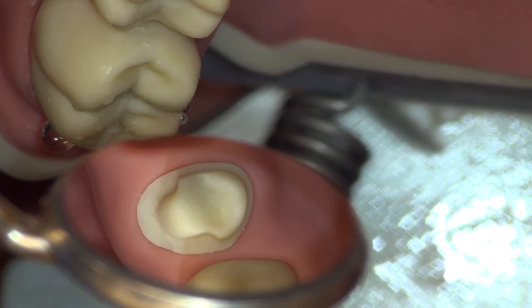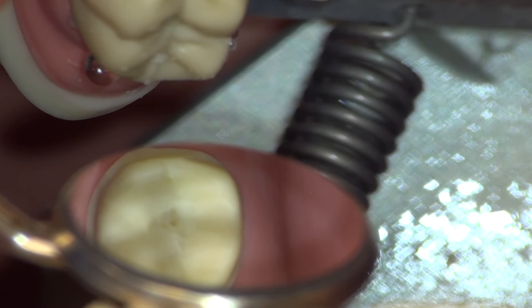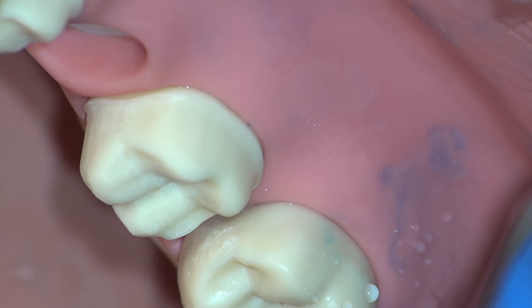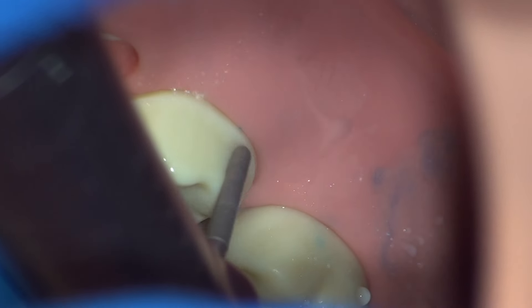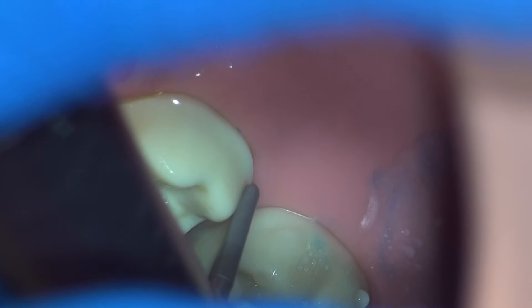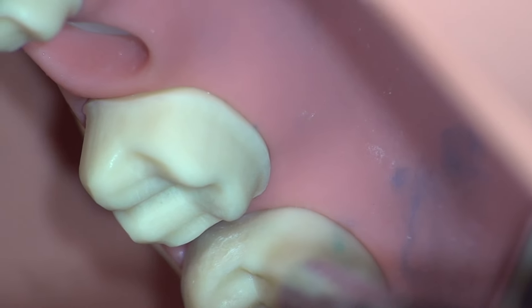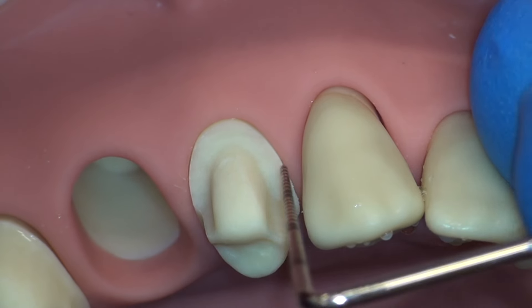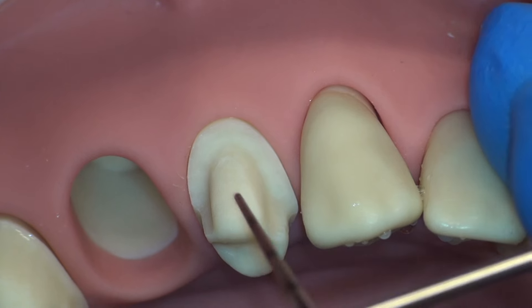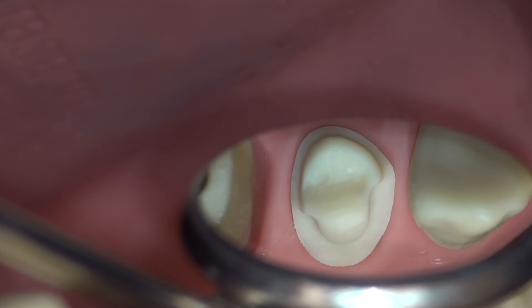Finally, we'll check our path of insertion and undercuts with the mirror. Here we can see a distal lingual undercut on the molar. We'll verify this visually, and then reduce with our burr at slow speed with a red diamond — it doesn't take very much to reduce out that undercut. We'll run our probe over our margins to have that nice crisp appearance, and we're done. We can assess our TOC and path of insertion from the buccal, as well as the occlusal, with the mirror.